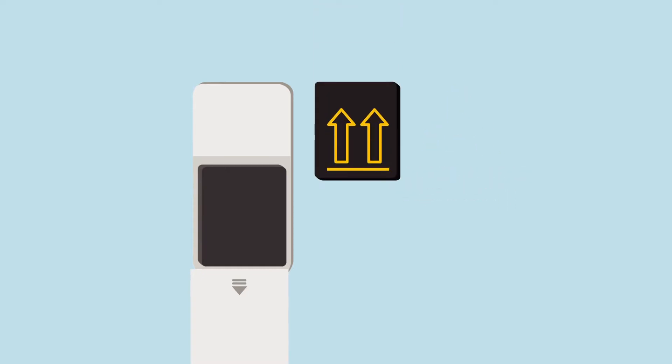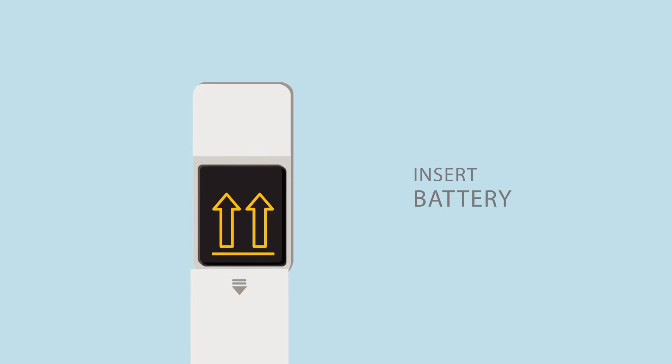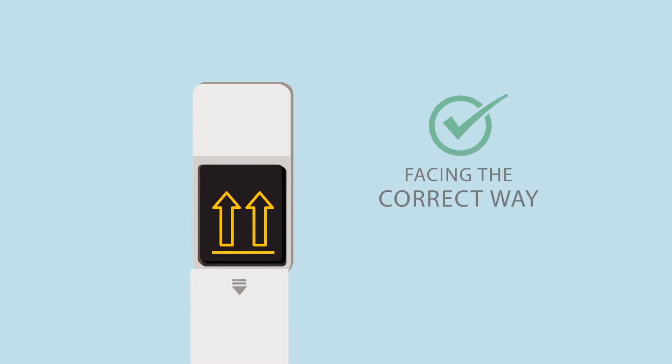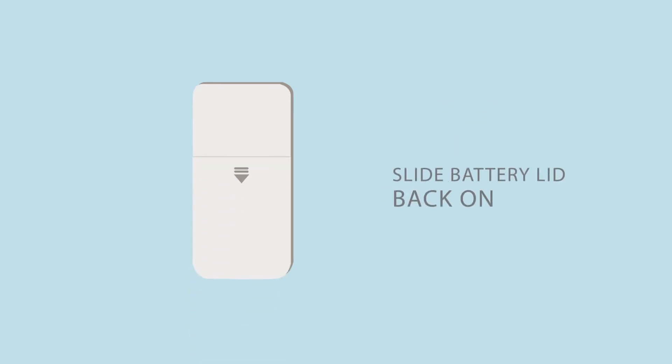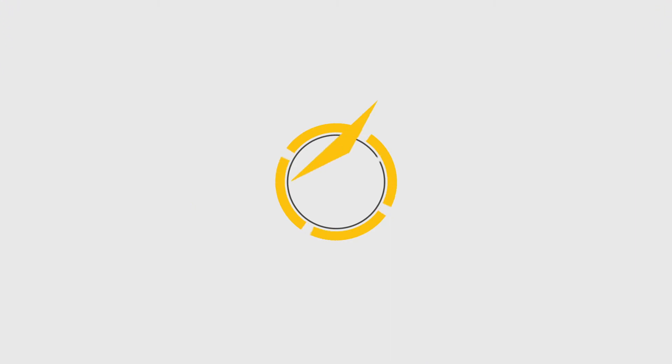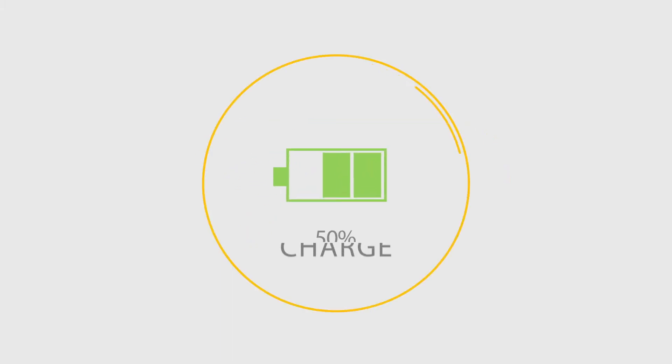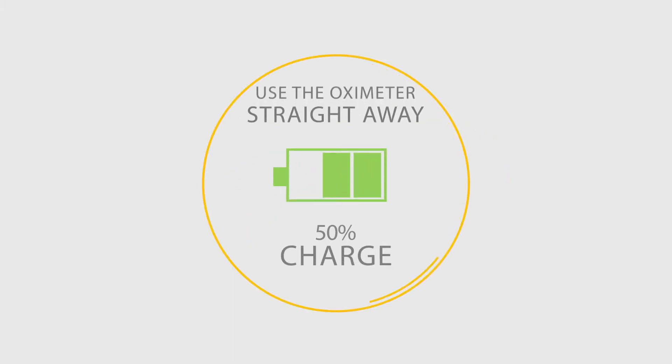Take the battery and insert it into the case. Make sure that the battery is facing the correct way. Slide the battery lid back onto the oximeter, you'll hear it click into place. The Lifebox Oximeter uses a lithium-ion battery, the same as in a mobile phone, and there are certain steps you can take to make the battery last longer. The battery arrives already half charged, so please feel free to use the oximeter straight away.